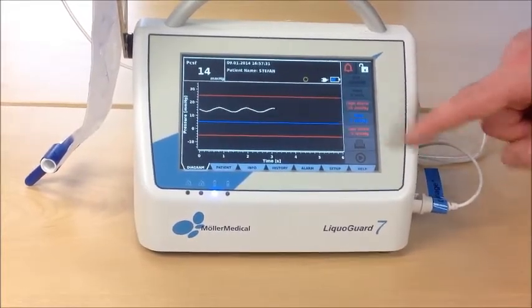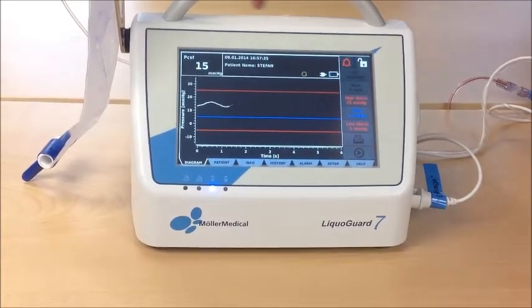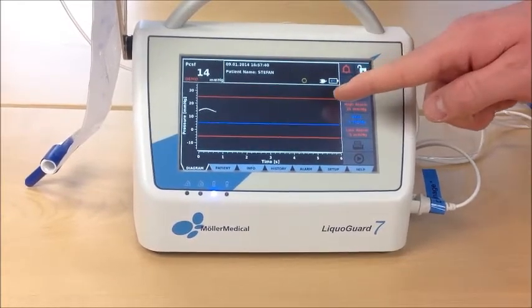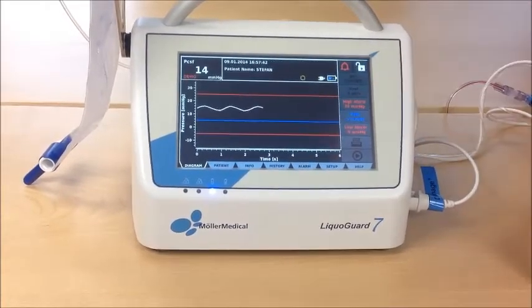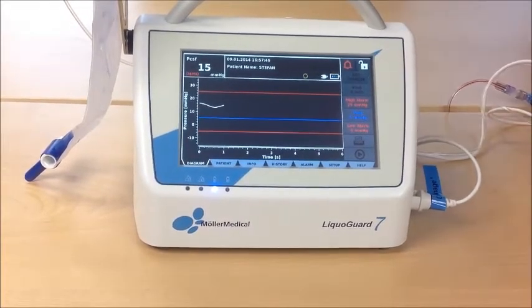Now, LifoGuard will constantly drain because it is unable to reach down to 5 mmHg with that low pump speed.